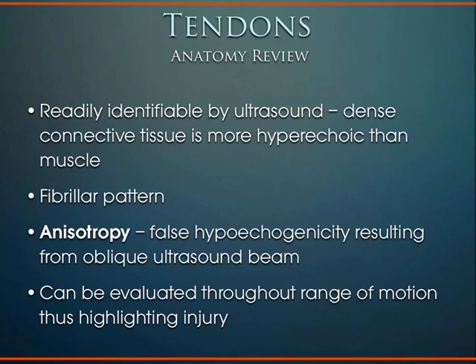It's what we call a fibrillar pattern. You can see the fibrils of the tendon tissue interspersed throughout that view. It's very hyperechoic, meaning it has a very strong, denser signal, not quite as much as bone, but there is a dense hyperechoic image to tendons.